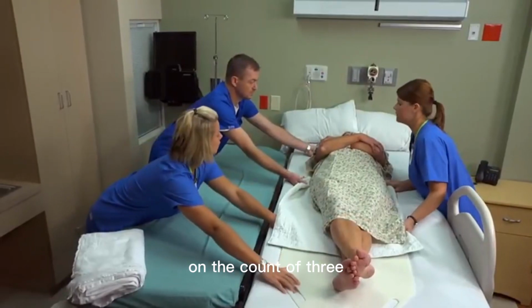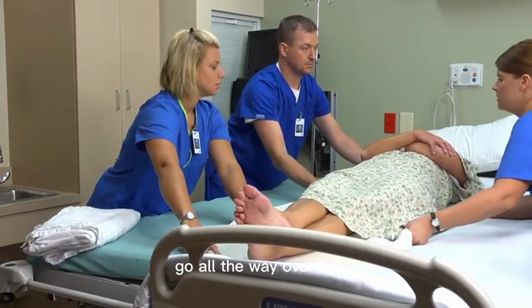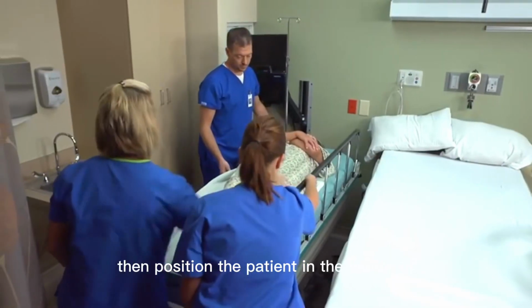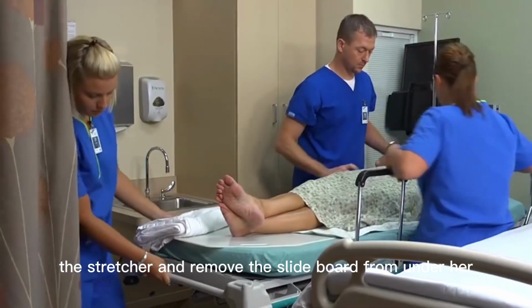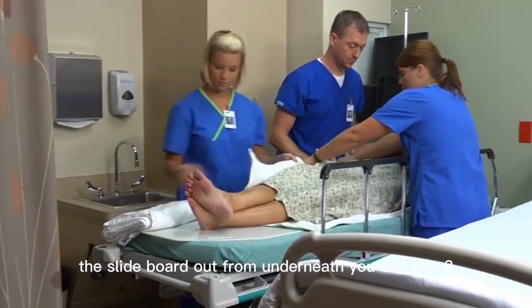On the count of 3, pull the slide board with the patient onto the stretcher. We're going to go all the way over. 1, 2, 3. Then position the patient in the center of the stretcher and remove the slide board from under her. Count of 3, we're going to pull you over and take the slide board out from underneath you. 1, 2, 3.